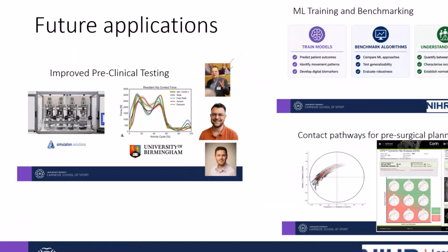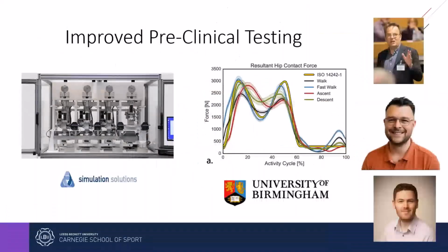So I'm hoping that the data set that we've released will go some way to improving preclinical testing. I know it's not as simple as saying, oh, we'll just use this waveform, given the fact some of the simulators can't actually do the excursions and the forces that we ask of them and what patients actually do. But hopefully, now that the data is there, this will go some way for people being able to do that.